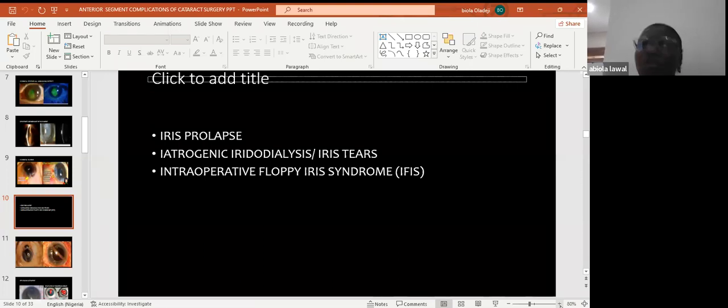So you have chronic traumatic mydriasis, and the patient can complain of glare and dysphotopsia. Sometimes you may need to do something about it. There are options of artificial iris devices. You can also do iris cerclage, a surgery to reduce the size of the iris, but it is fixed, and then there's usually no possibility of a future dilation. Usually 4 mm is the size the iris is reduced to, to enable posterior segment examination.